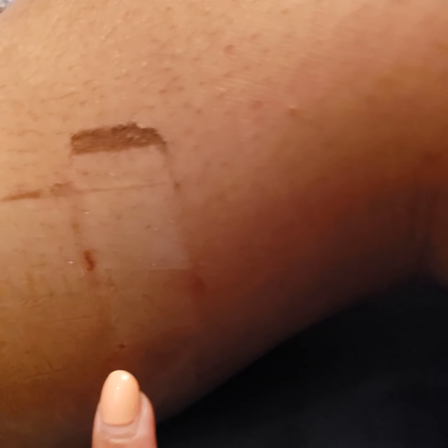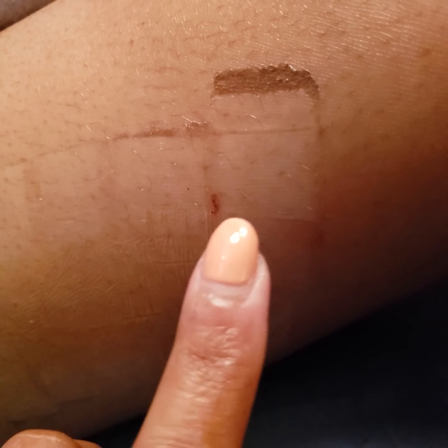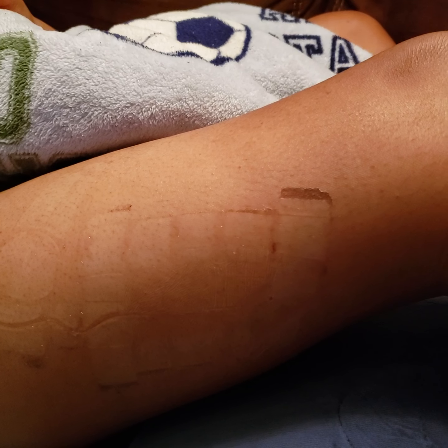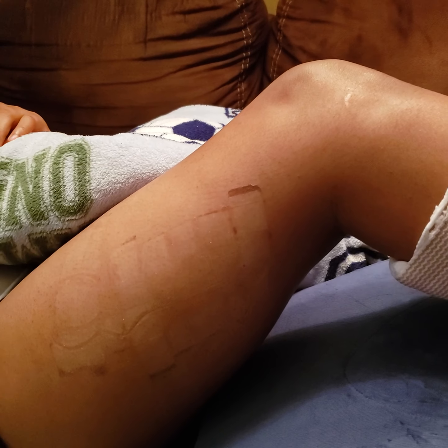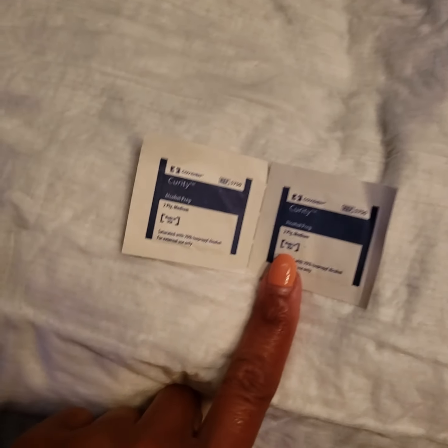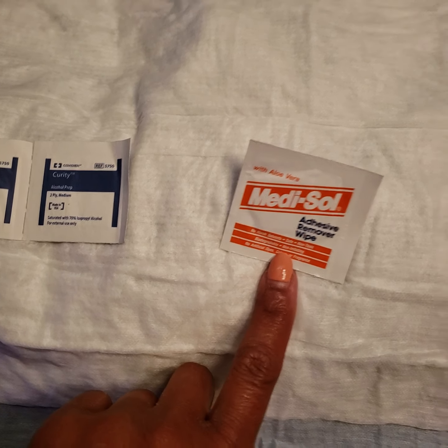No bleeding — that's good. I can't even see where the insertion point was. The skin irritation is just from the tape — the tape literally ripped my skin. It wasn't as bad as I expected, but it does feel really weird when you're pulling it out. Again, the most important part: make sure you have either alcohol wipes or adhesive removal wipes, which you can get from the hospital.